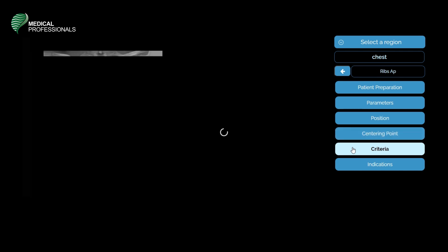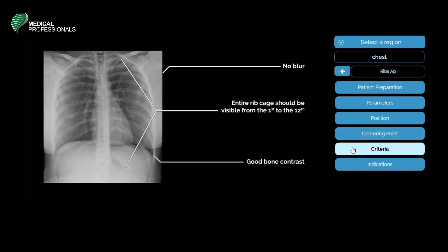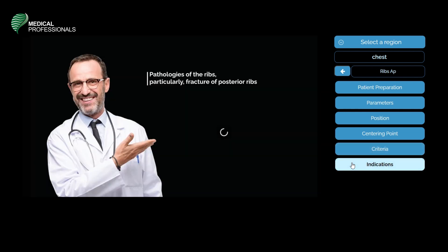The evaluation criteria for the AP ribs: there should be no blurring in the image, the entire rib cage should be visible from the 1st to the 12th rib, and there should be good bone contrast. The indications of a rib X-ray in the AP position aim to rule out pathologies of the ribs, particularly fractures of the posterior ribs.